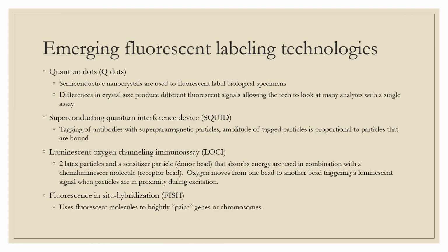There's a lot of emerging fluorescent labeling technologies as well, including quantum dots, also known as Q dots. I'm not super familiar with this type of fluorescent labeling technique, but Q dots are used to label live biological material in vitro for research. We also have superconducting quantum interference devices, also known as SQUID, which is used to measure extremely subtle magnetic fields and used to measure cardiac risk in the laboratory.